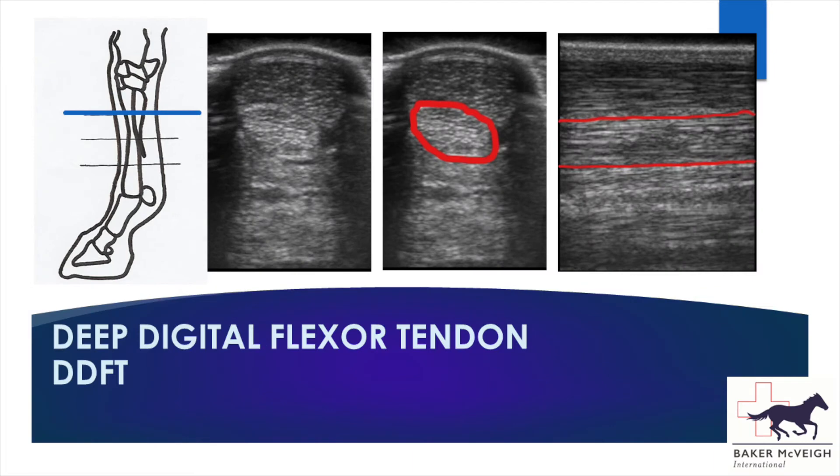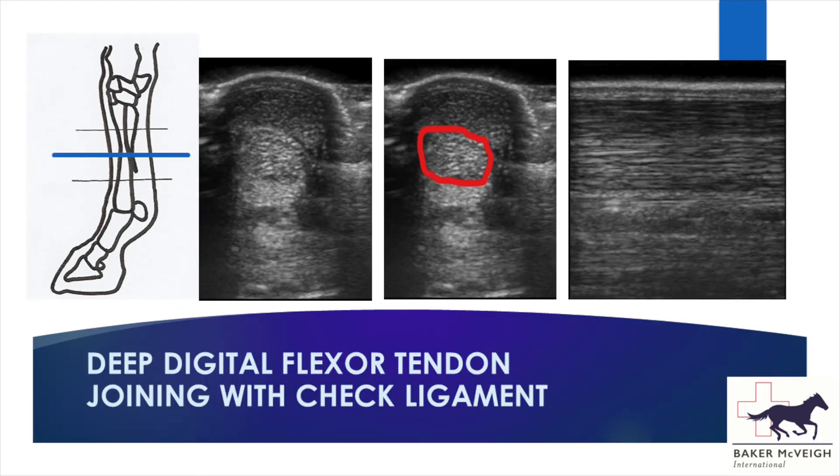Moving on to the deep digital flexor tendon, this is the oval-shaped tendon sandwiched between the superficial digital flexor tendon and the accessory ligament. On the longitudinal view you can see a really nice appearance of long parallel lines, which represent a good fibre pattern of a healthy tendon.